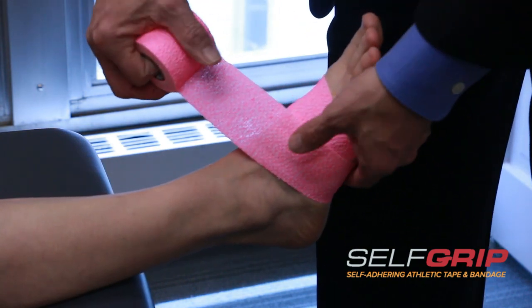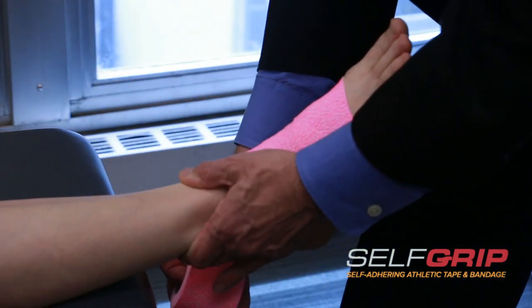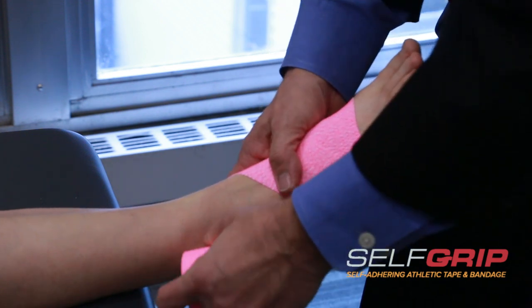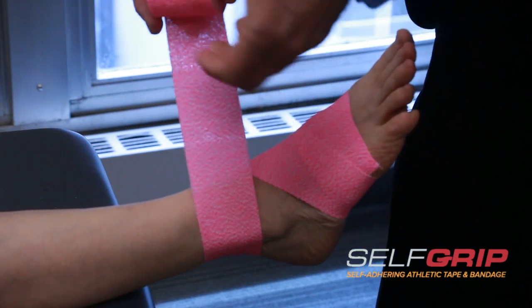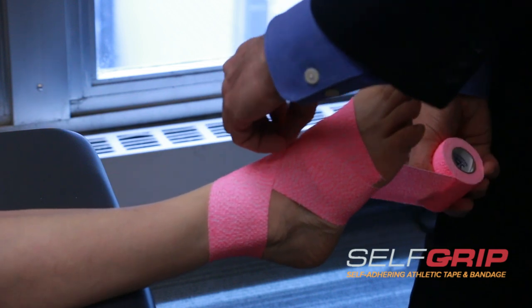What we're going to do is pull the foot up a little bit. We've lifted it up and we're going to do what we call a figure eight — coming down and around, making that figure eight right in here.